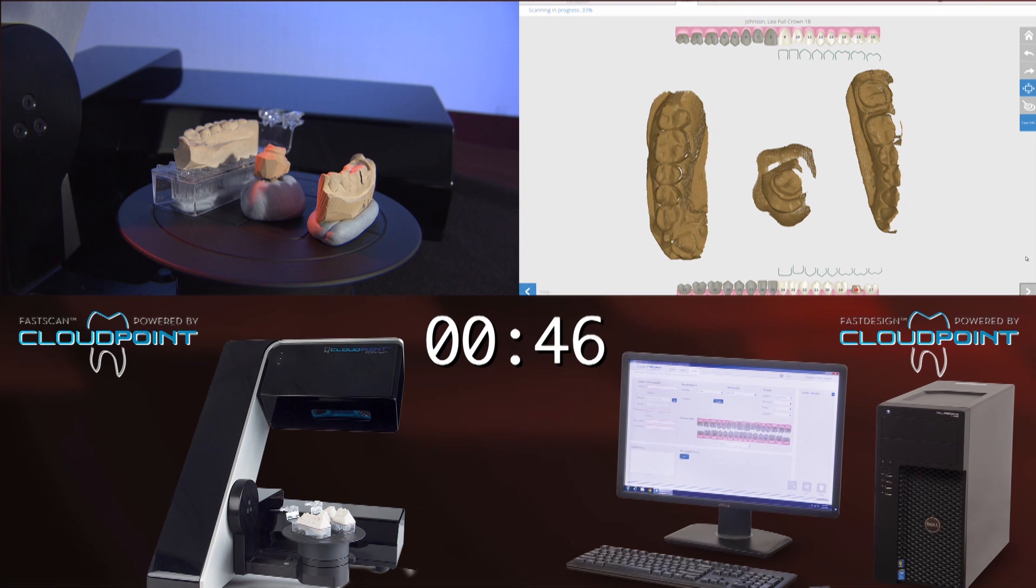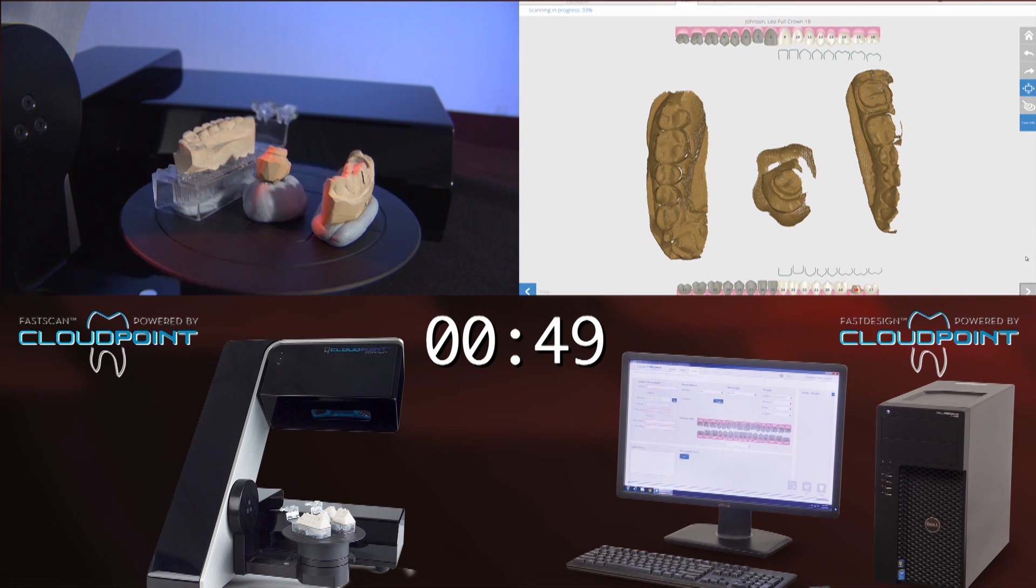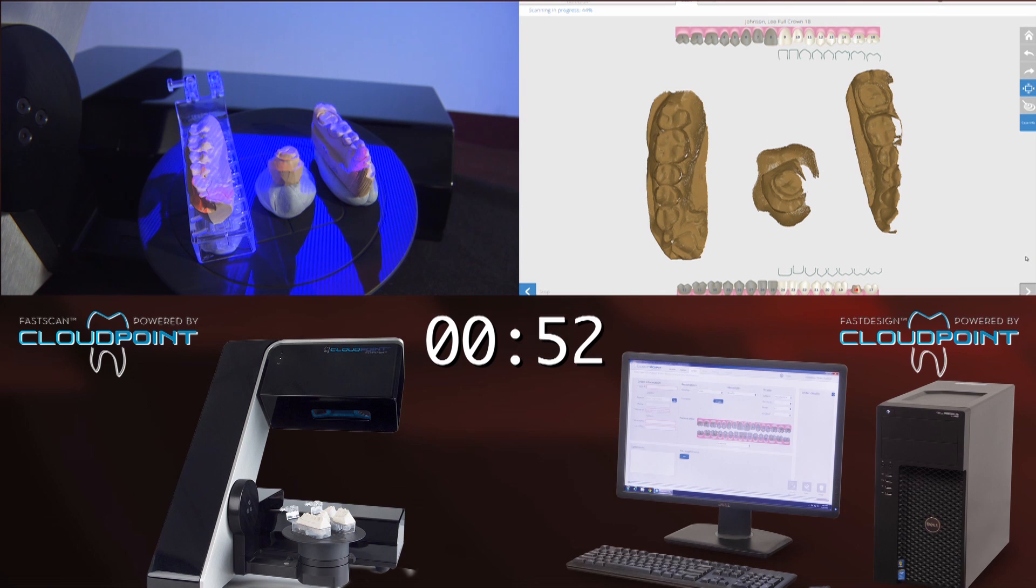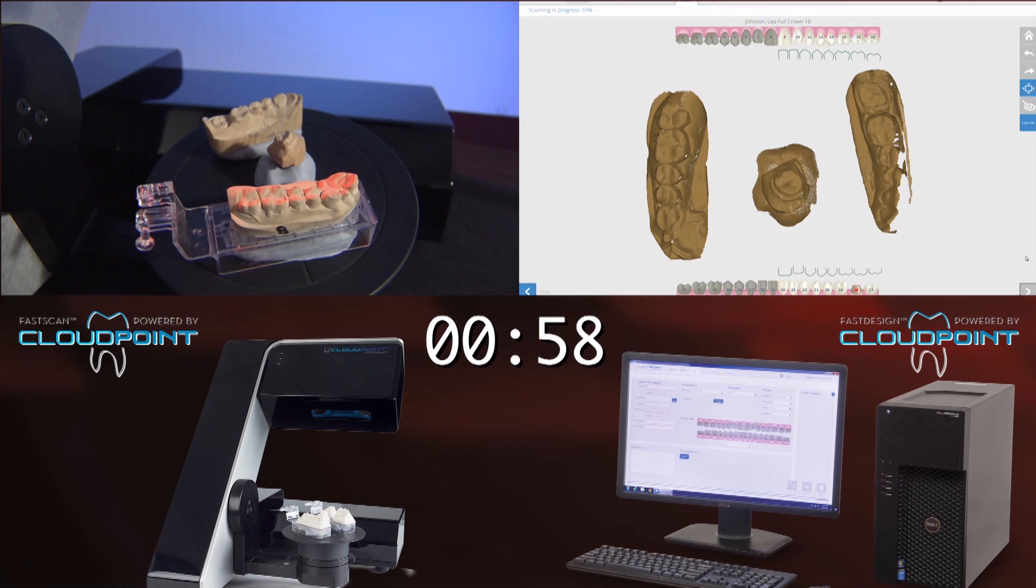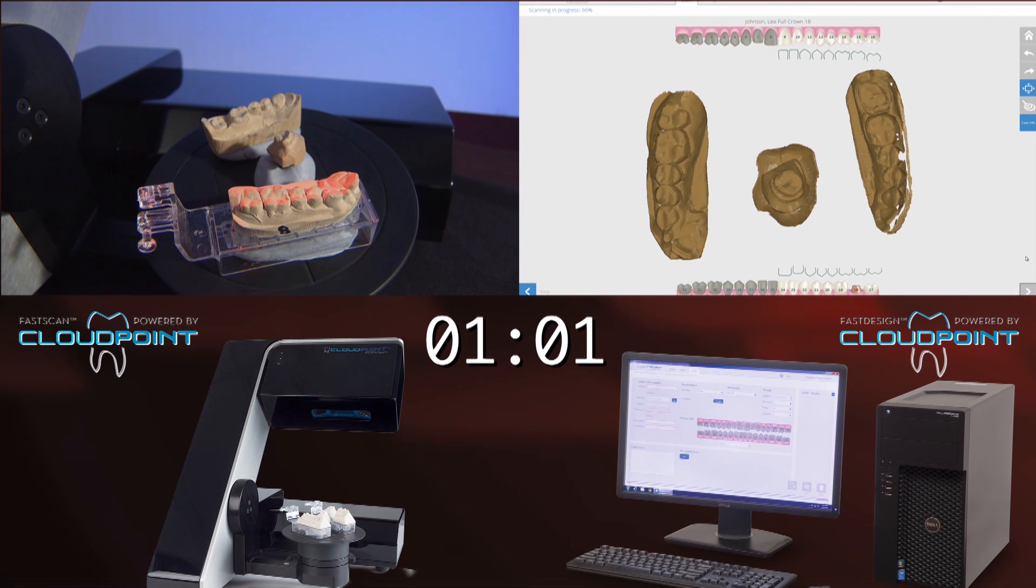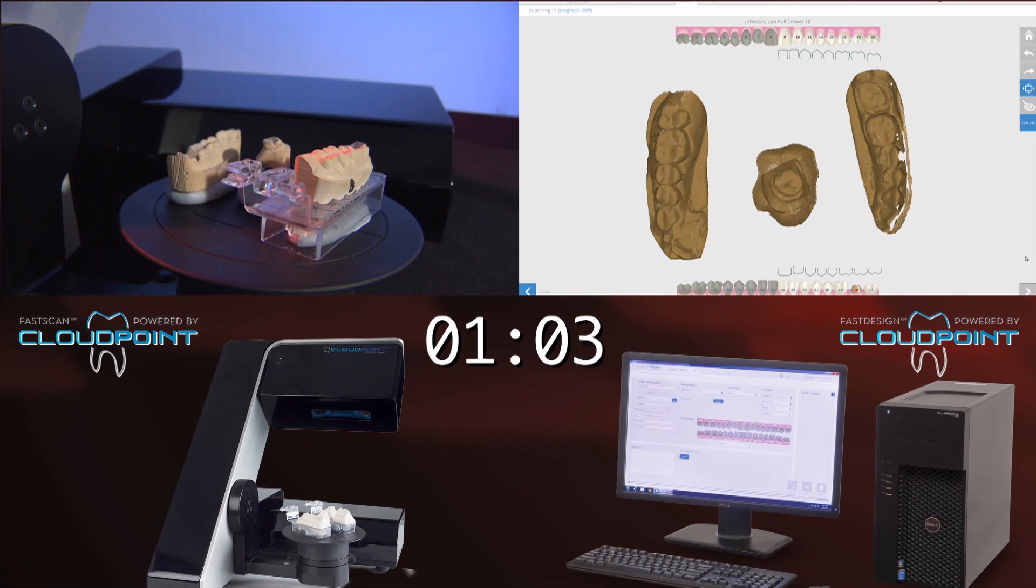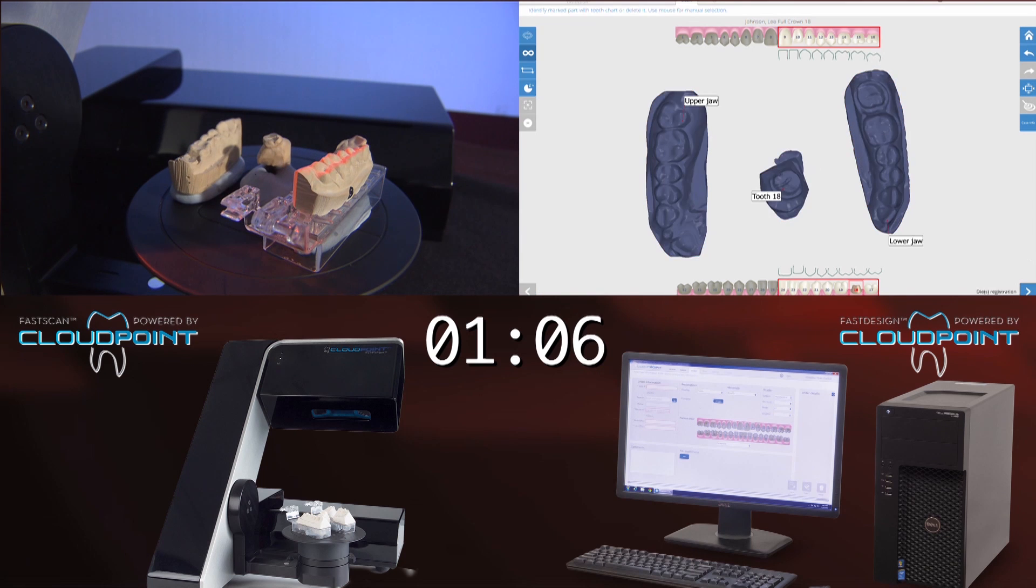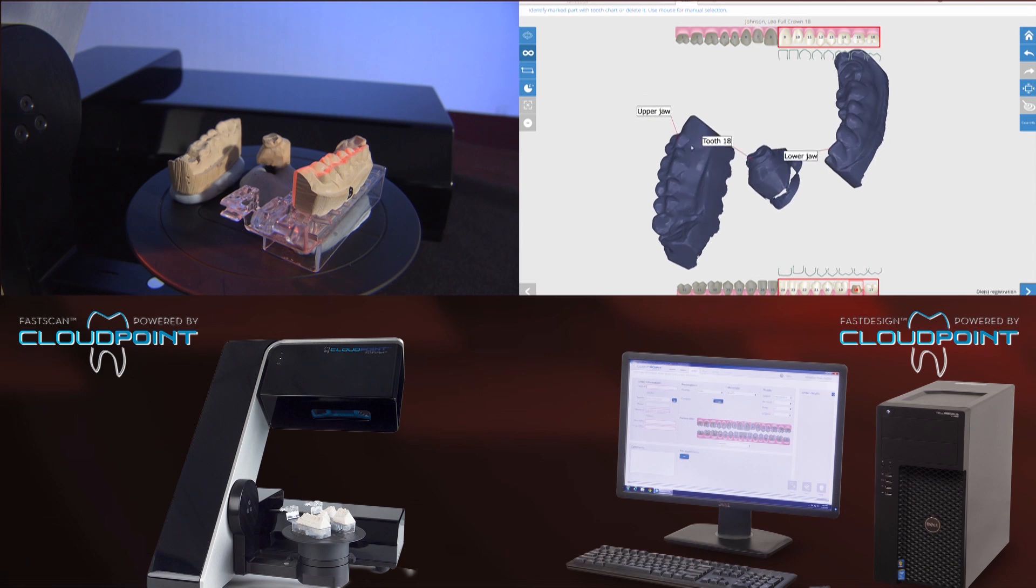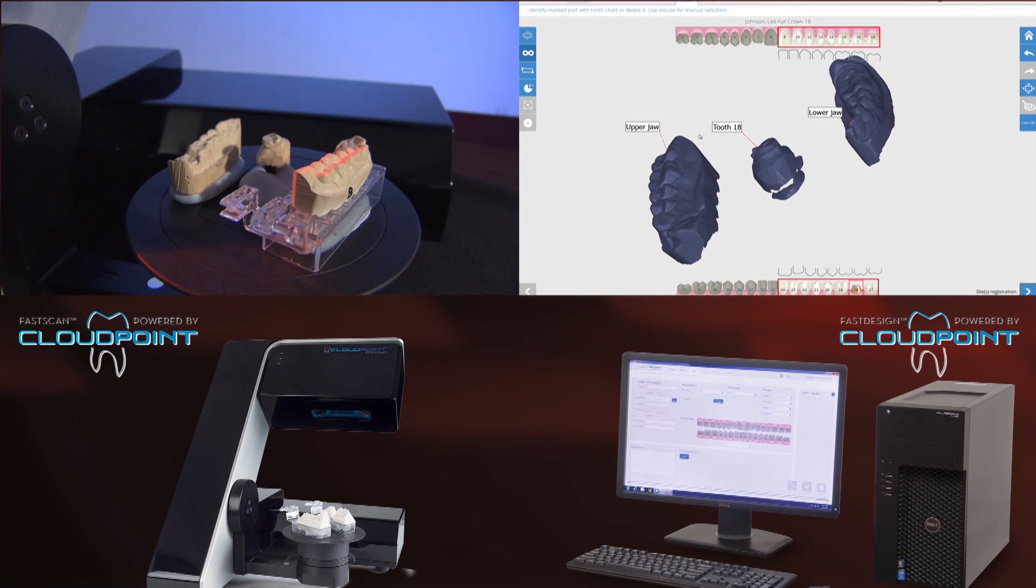By grabbing it at all these different angles and then stitching it together, it's able to pick up this information not unlike if you had a digital impression unit in the patient's mouth and you were moving it from buccal to lingual, mesial to distal in the patient's mouth. But of course, the big advantage here is there's no tongue, there's no saliva.